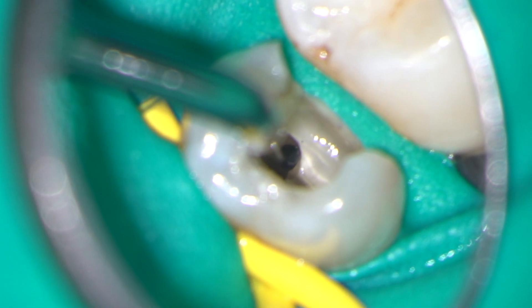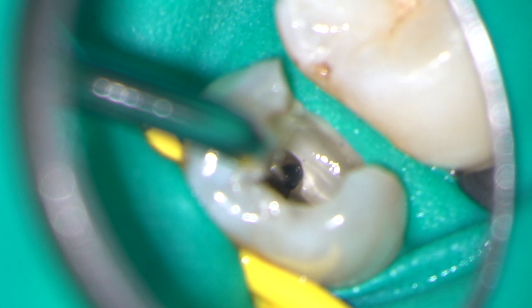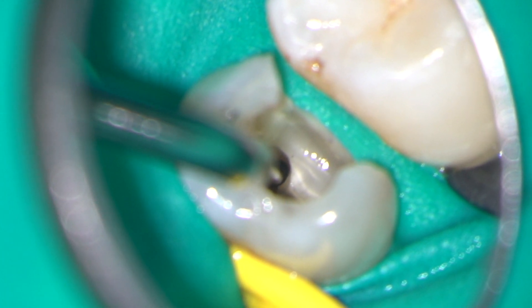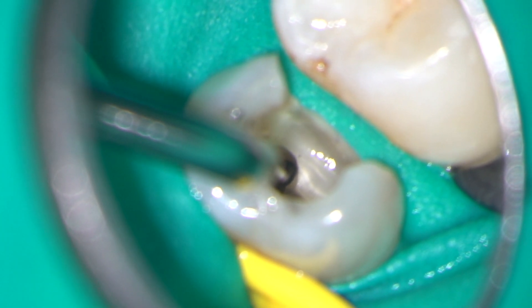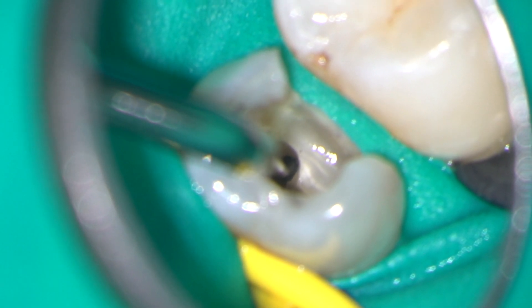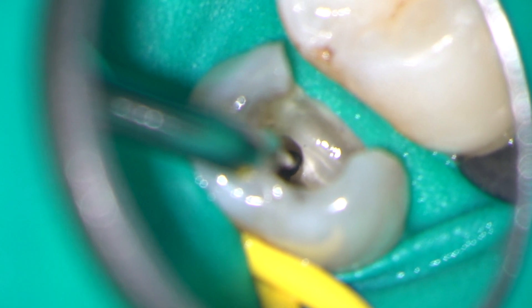I am using an Action ET25 tip which I have pre-bent to reach the piece of instrument in the apex of the distobuccal canal. By pre-bending the instrument, I am going to avoid removing dentine coronally.